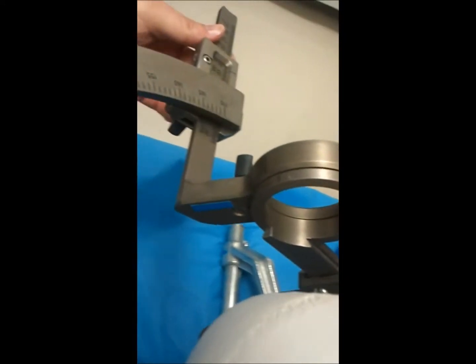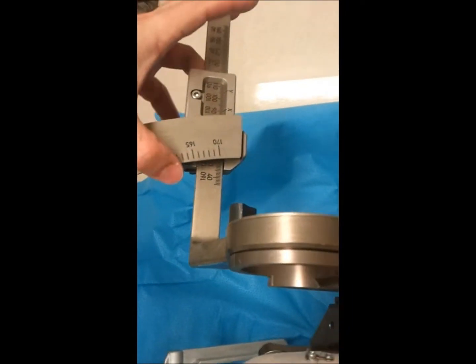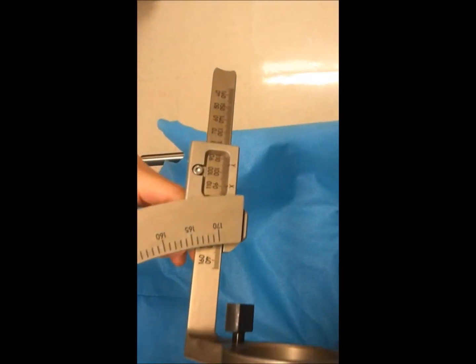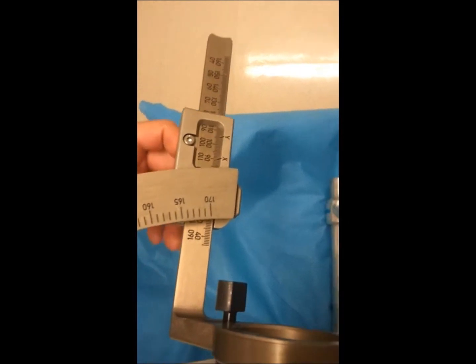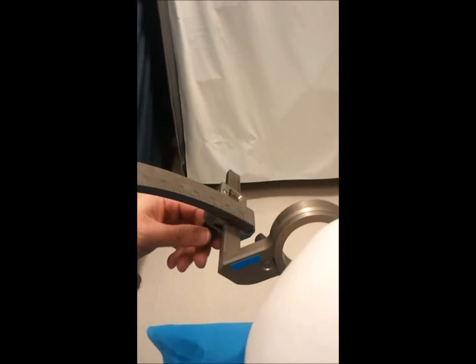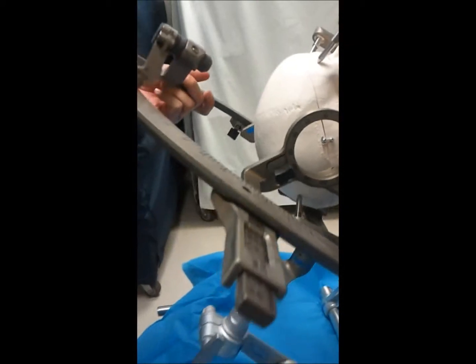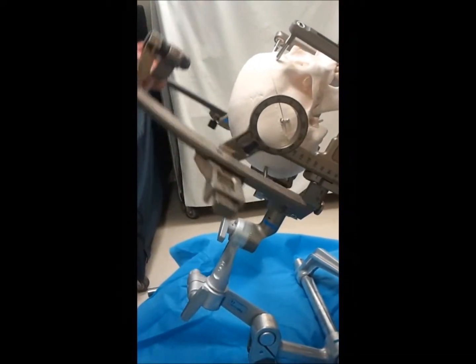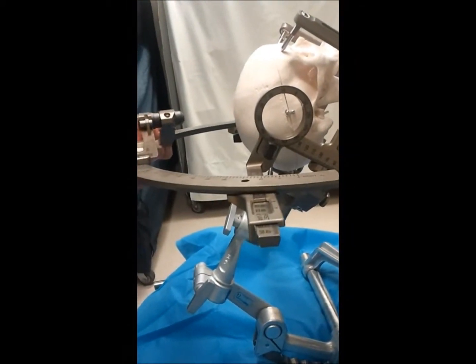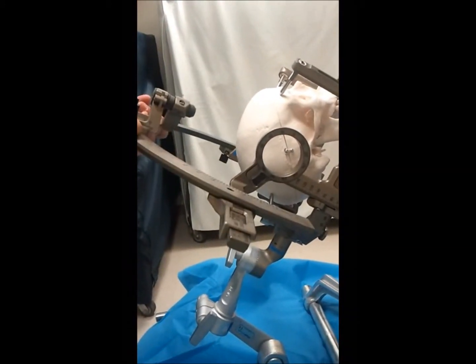But the main thing you need to check is that this is pushed all the way medially, and then there's a screw on the bottom here that you need to tighten to lock that in. And I'll show that to you here by adjusting that. This screw here needs to be tight. And now the arc is securely attached to the patient, and even though I'm loose on the ring, as long as I don't drop this and let it get contaminated, we're safe to use it as needed.